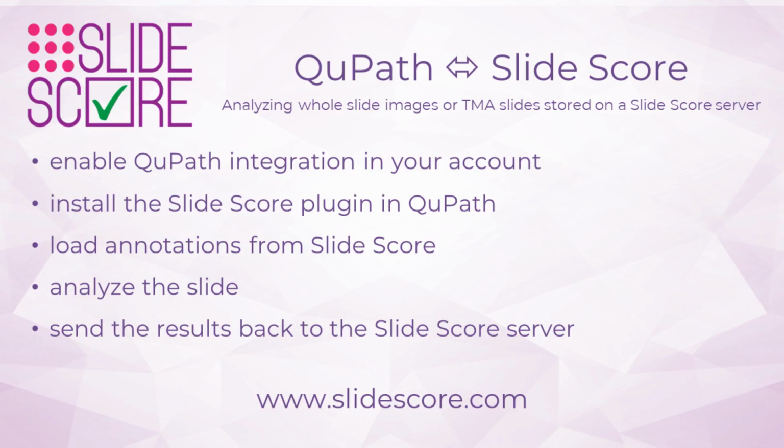This video showed you how to enable QuPath integration in your account, install the SlideScore plugin in QuPath, load annotations from SlideScore, analyze the slide, and send the results back to the SlideScore server to share with your colleagues.